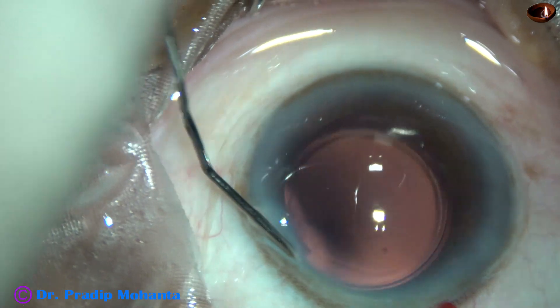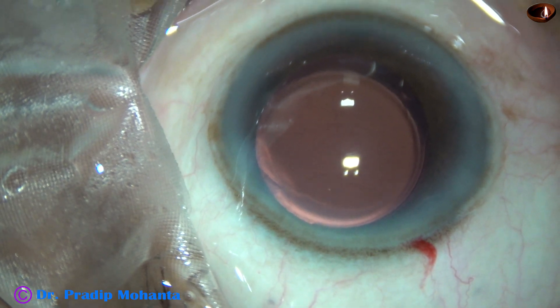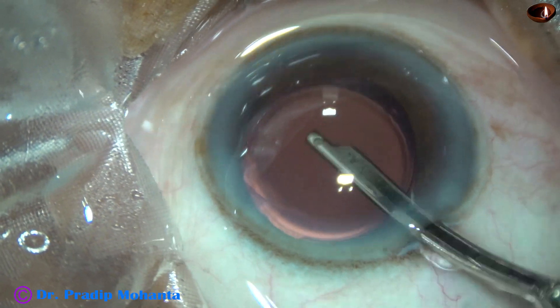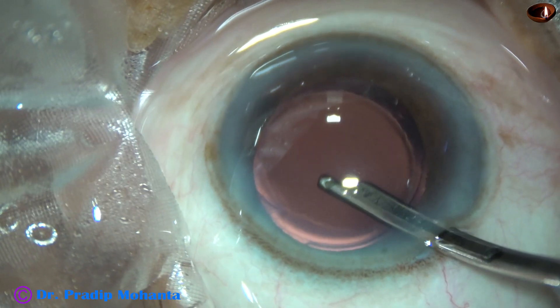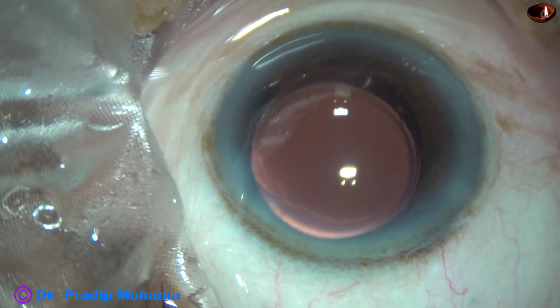The single side port is closed by hydrating the corneal stroma on either side of it. After that, this is the final lavage of the anterior chamber. Any residual viscoelastic sticking to the corneal endothelium is removed.